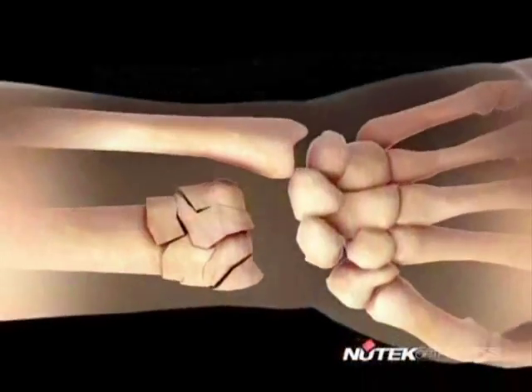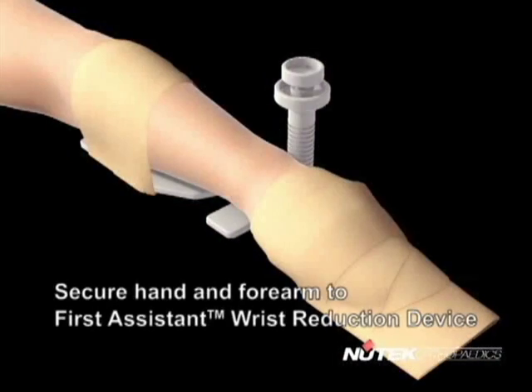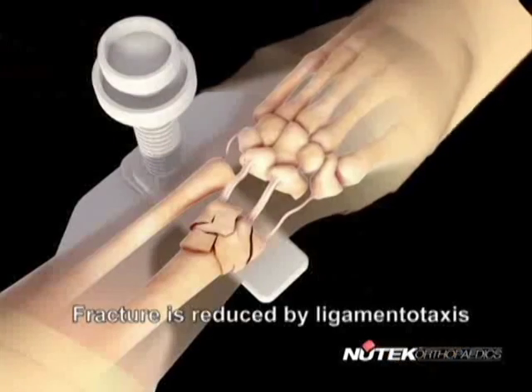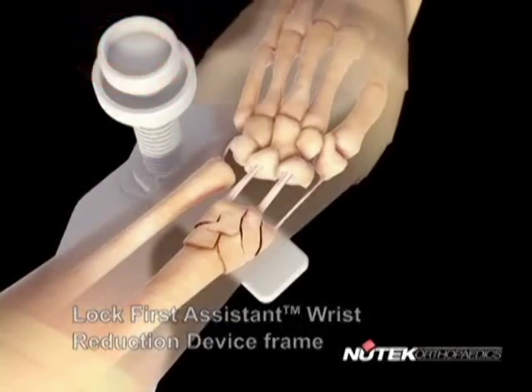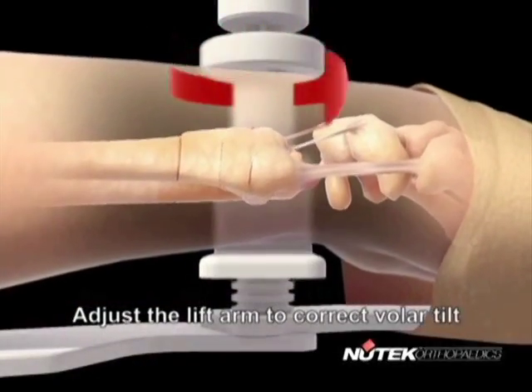First, we secure the hand and forearm to the first assistant wrist reduction device. Capture the base of the thumb with the lift arm positioned under the fracture. The fracture is reduced by ligamentotaxis. Lock the first assistant wrist reduction device frame. Adjust the lift arm to correct the volar tilt.